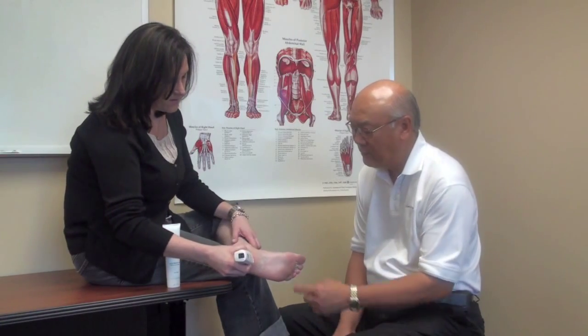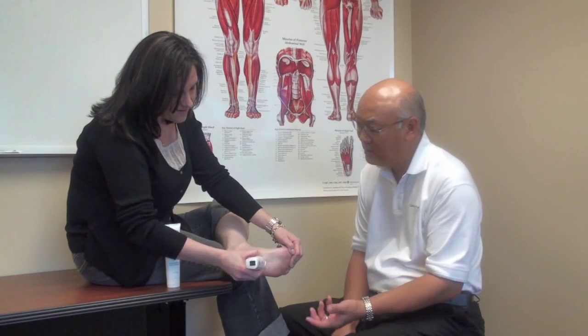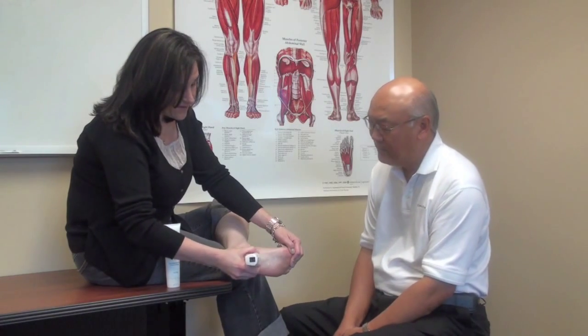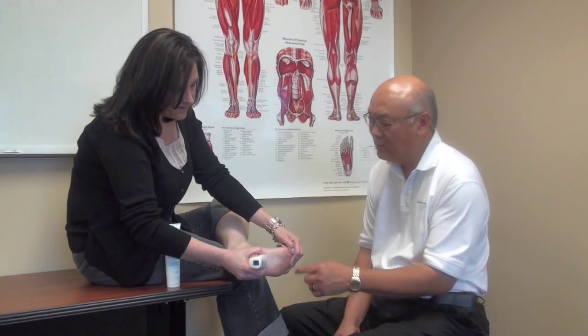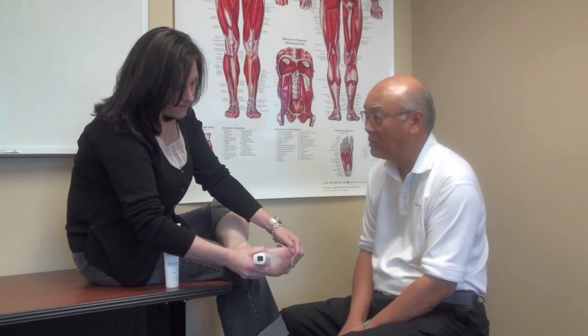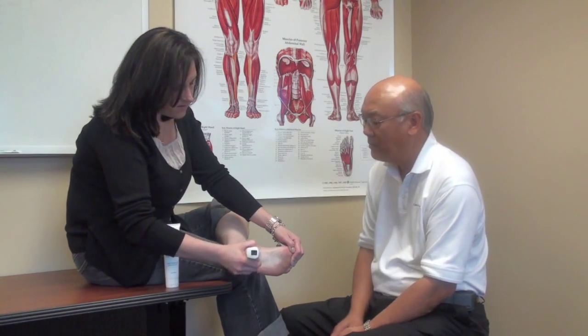Why don't you go treat a little further down and pull your toes back — do you feel how that muscle actually comes to the surface? Work that a bit and see how that feels. It feels really good. So these muscles connect to that spot where it hurts. If these muscles are tight, that spot will continue to hurt. If you do this on a regular basis and get those muscles relaxed more, it should help better.